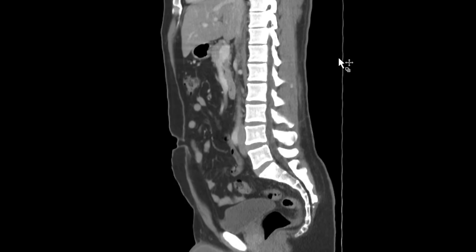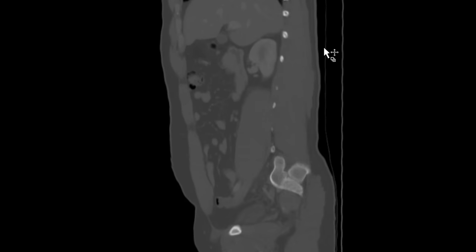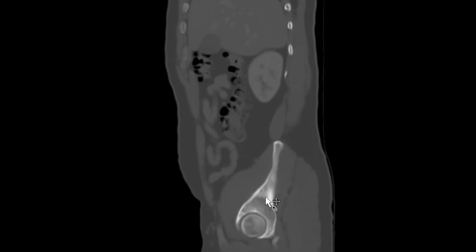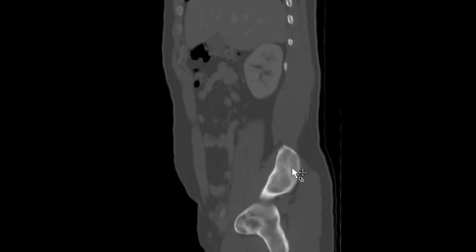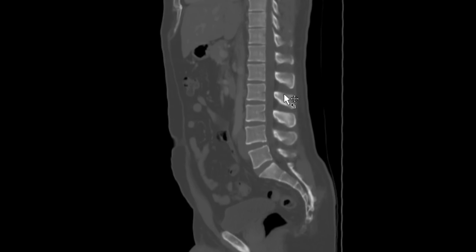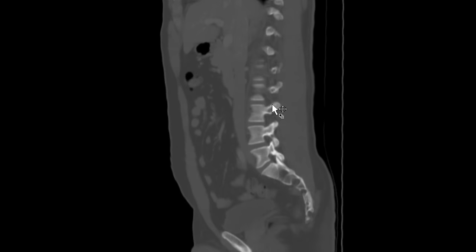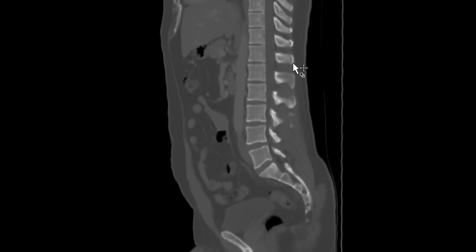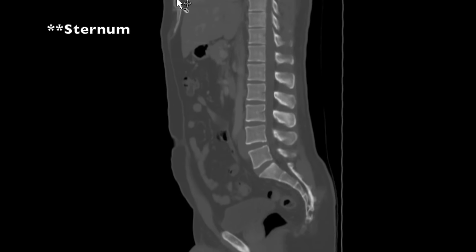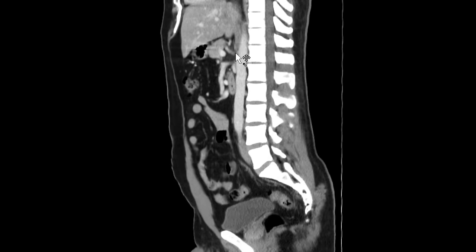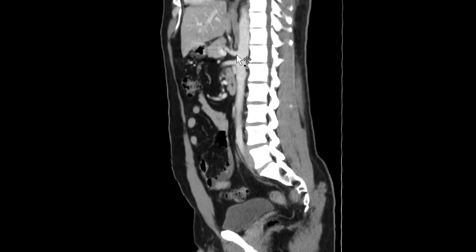Next I go to the sagittal view and take a look at the bones on the sagittal projection — acetabulum, femoral head, iliac wing, sacrum, L5 all the way up — making sure there's no big degenerative change or osseous lesion. You can catch a little bit of the sacrum and the xiphoid process as well. Also while I'm here I take a look at the vessels on sagittal projection: celiac axis, SMA, and aorta.